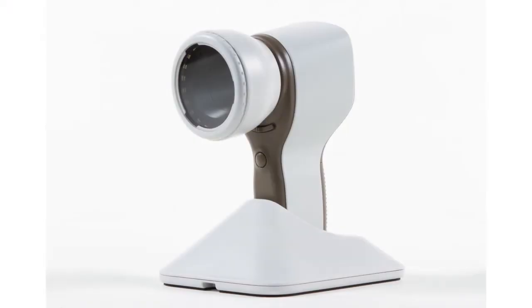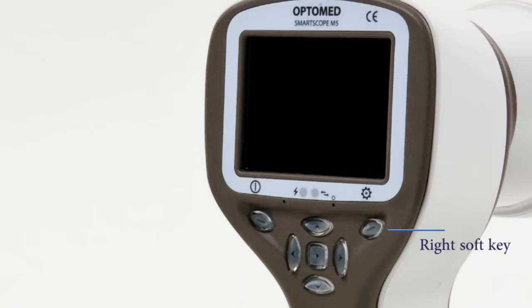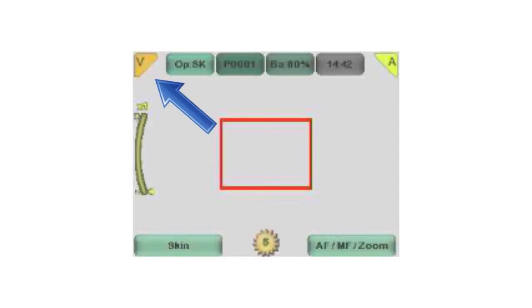Image settings. Capture mode: still or video capture mode is selected in the SK menu. To activate the menu, press and hold the right soft key. The icon on the screen indicates the selected mode.